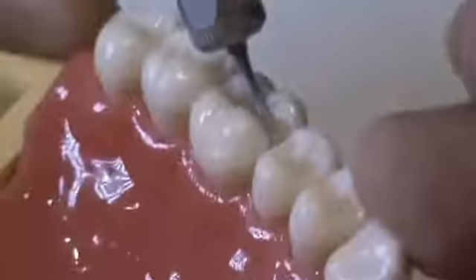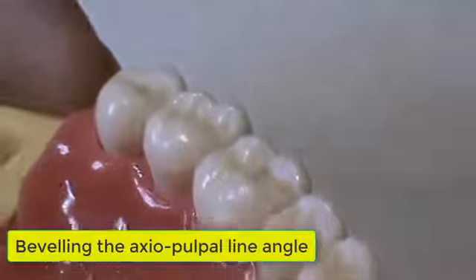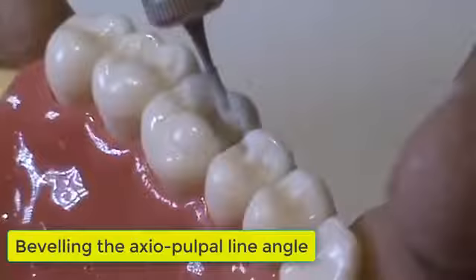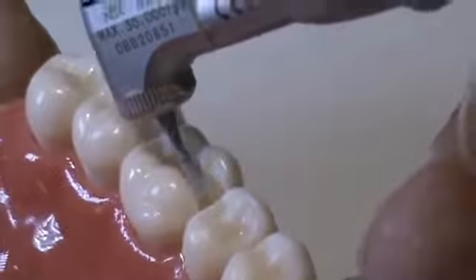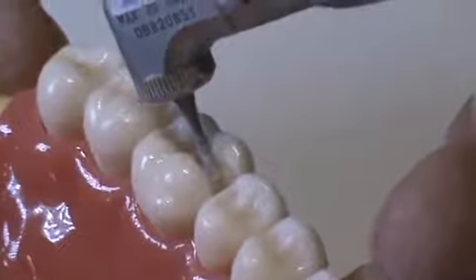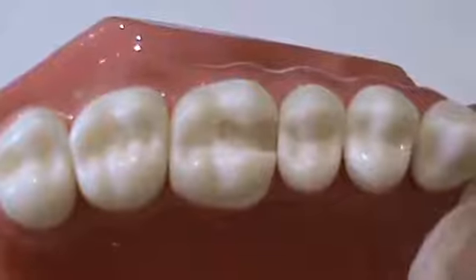Step 4. By holding the fissure burr at 45 degrees, we bevel the axiopulpal line angle. Like so. And now the cavity is finished.